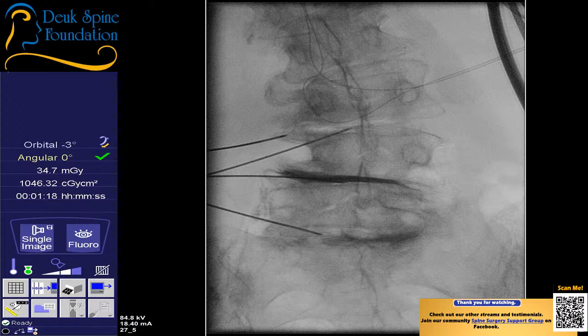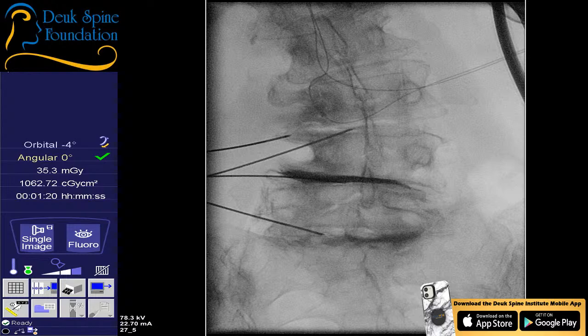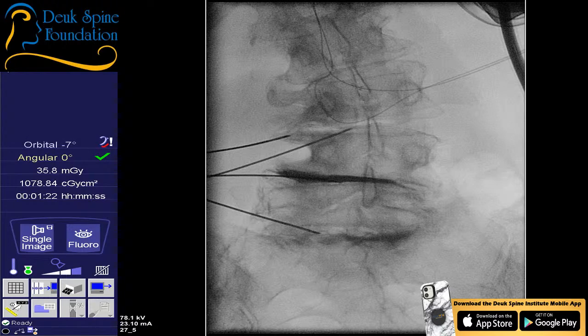Would you rotate your AP a little bit to get that spinous process just a little more lined up? Not much. Shot? That's a little better. That's funny, huh? Let's go a little more and see what happens. I want to see the pedicle on my side a little better at L4. Try the other way. Look how the pedicles are way off. Keep going. I think that's getting worse. Yeah, go the other way. Keep going. Let's go a little further.